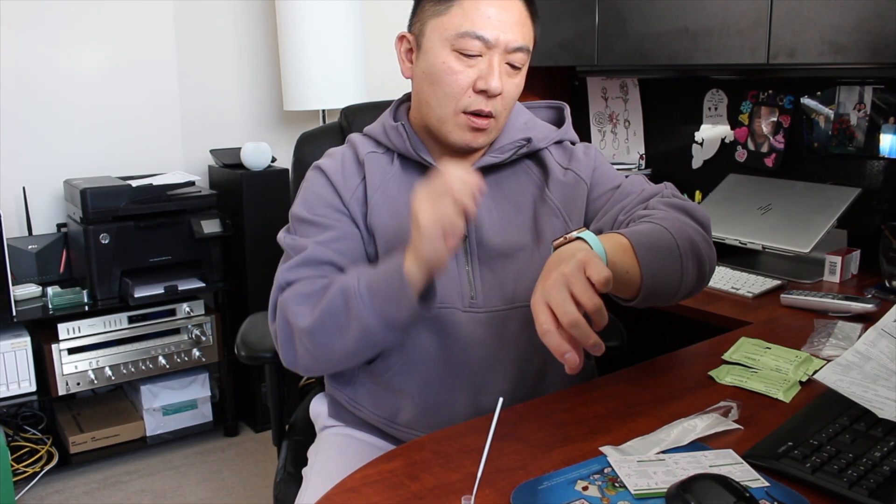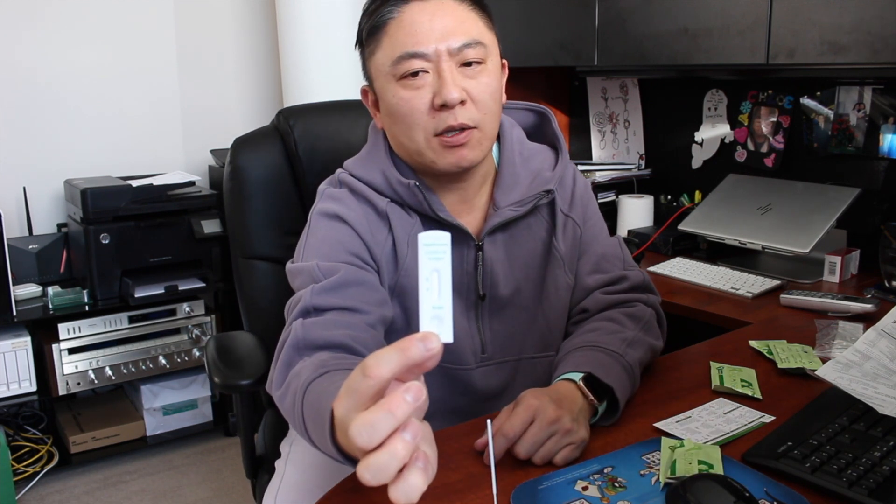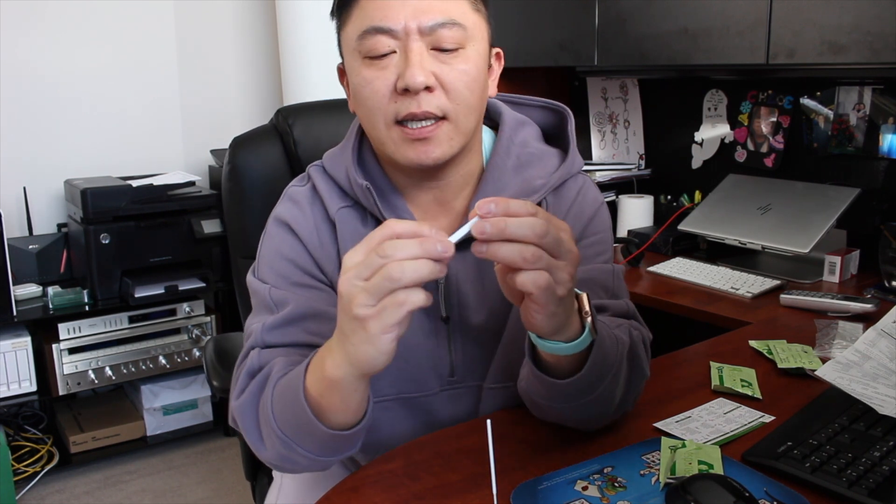It says to let this sit for two minutes in the reagent, so I'm setting a timer and we'll come back. With about a minute left on the timer, I'm going to open up one of these green-sealed packages — the COVID test cassette. It looks just like a pregnancy test kit. When you put the drops onto the indicator spot: two solid lines on C and T means positive for COVID-19; a line on C but nothing on T means negative; a line on T but no line on C means the test is invalid and must be repeated.